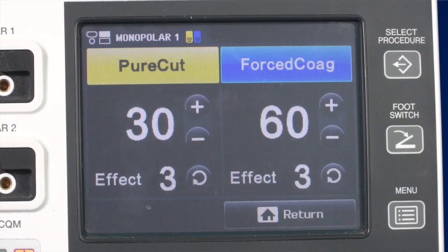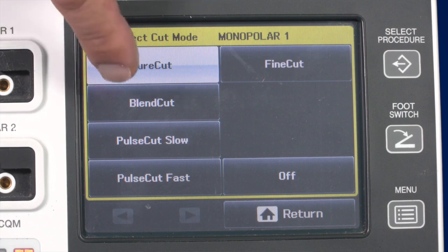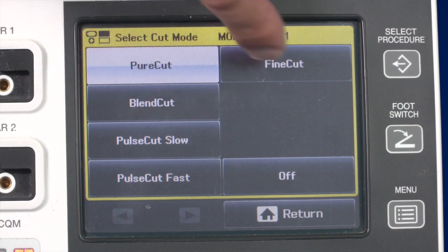For standard surgical applications, there are three important cut modes: pure cut, blend cut and fine cut. The pure cut mode allows you to cut tissue as if you were using a scalpel with little to no haemostasis. If you desire a cut mode with a greater haemostatic effect, use the blend cut mode. The fine cut mode is used with thin instruments, such as a needle electrode.